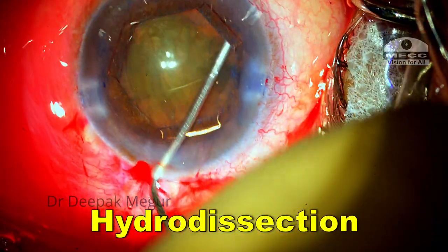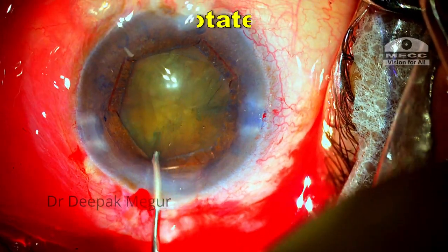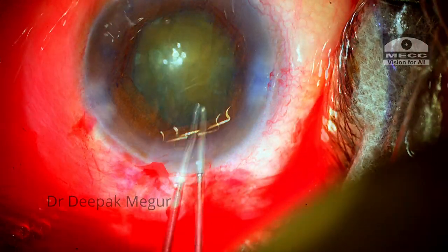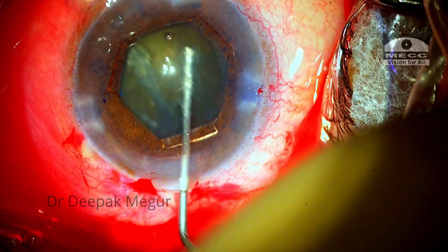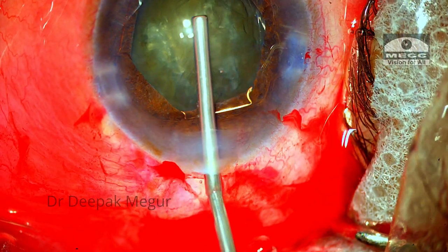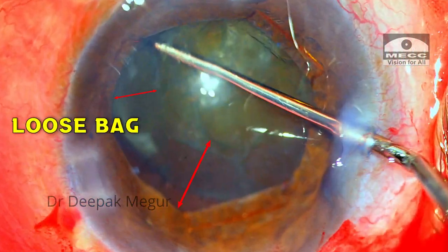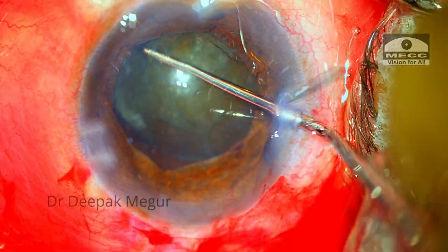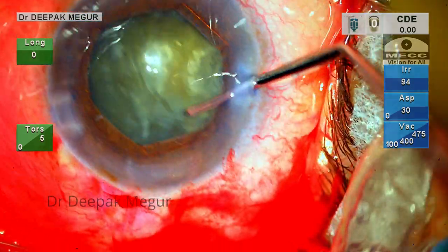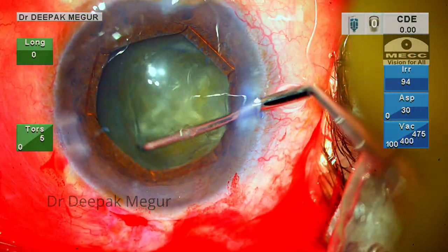I perform cortical cleaving hydrodissection and decompress the bag, but it seems quite difficult to maneuver or rotate the nucleus because the cortico-capsular adhesions are quite strong. I inject viscoelastic to pressurize the eye and attempt rotating the nucleus. It seems the bag is also trying to rotate, but finally the bag disengages from the nucleus-cortex complex and the nucleus can be rotated.